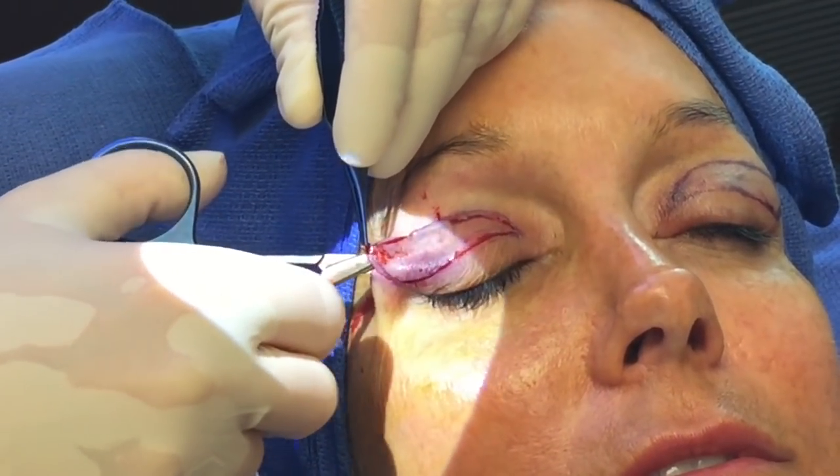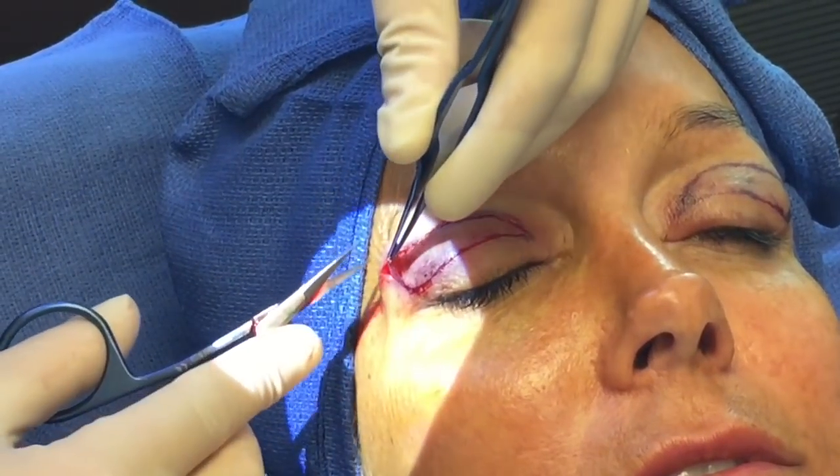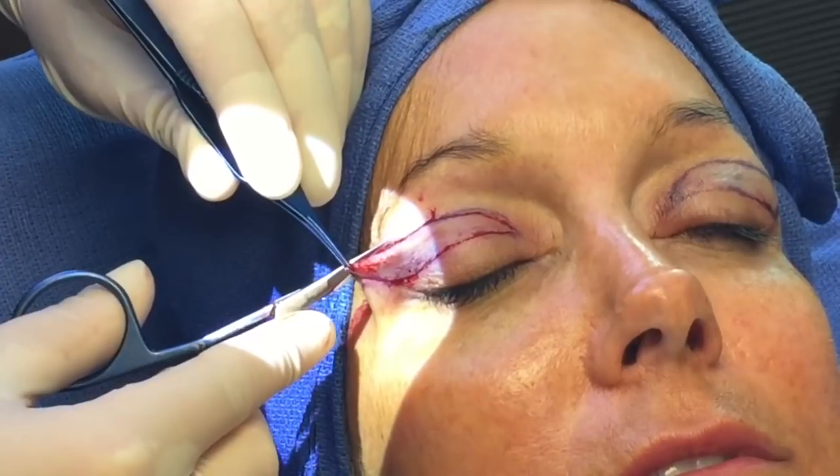I'm using as little cautery as possible so that there's less scarring, less tightness after the procedure, and fast healing and return to everyday activities.